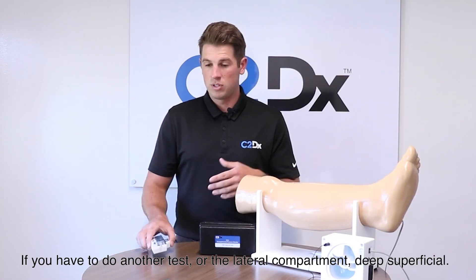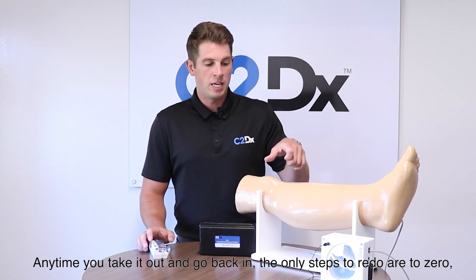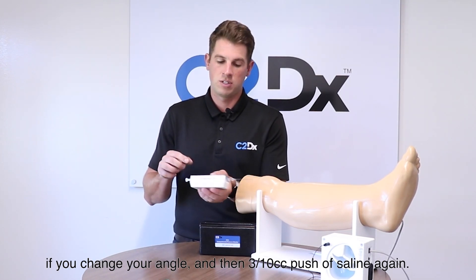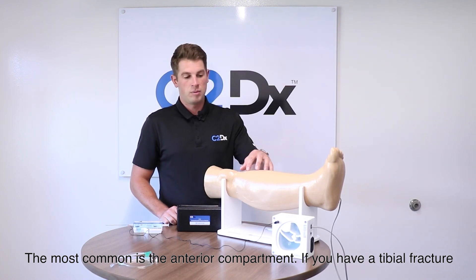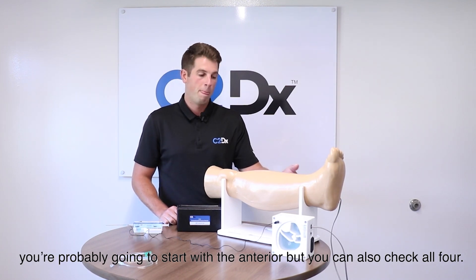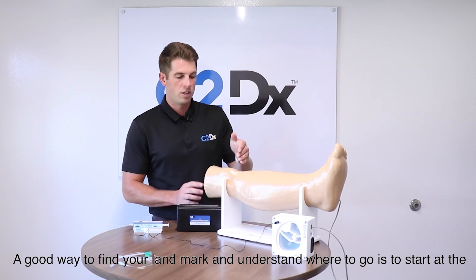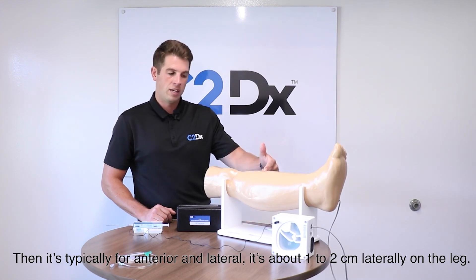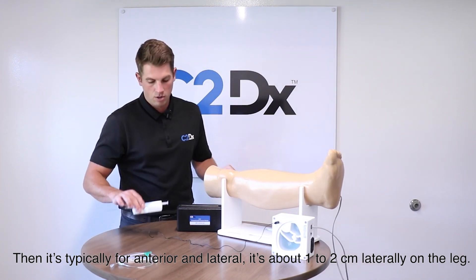If you need to do another test — the lateral, deep, or superficial compartment — any time you take the needle out and go back in, you only need to re-zero if you change your angle, then do the 3/10 cc saline push again. There are four compartments in the lower leg: anterior, lateral, deep posterior, and superficial posterior. The anterior is most common — with a tibial fracture you'll likely start there. A good way to find your landmarks is to start at the patella, go about a third down the midline, then one to two centimeters laterally for the anterior or lateral compartment.